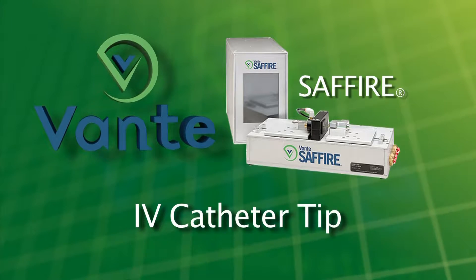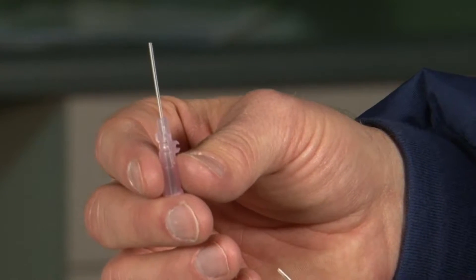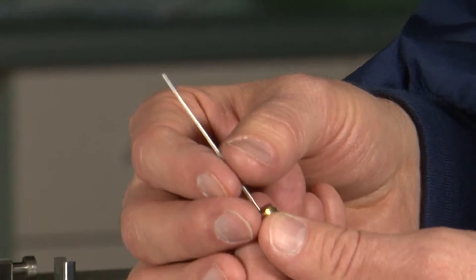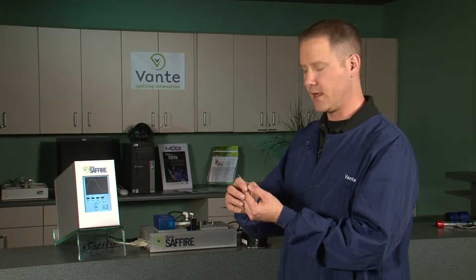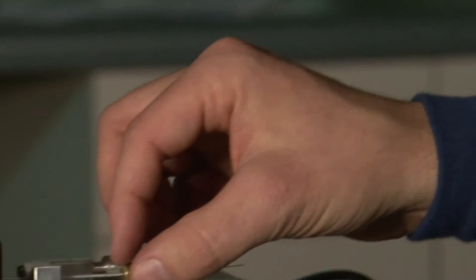The application we're demonstrating is our ability to create a tip on the end of an IV catheter, flash-free. I have a preloaded FEP shaft here with barium sulfate stripes. We're going to be inserting this into the mold, putting a nice taper on the end of the catheter, and trimming the excess plastic or flash off the end of the catheter in one step.